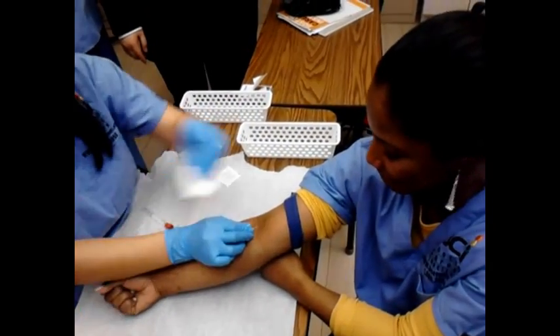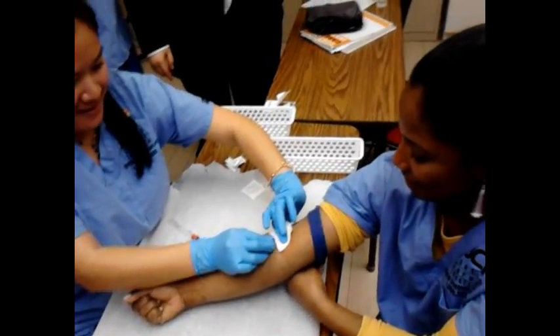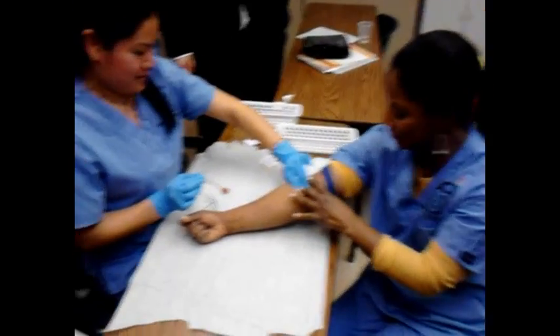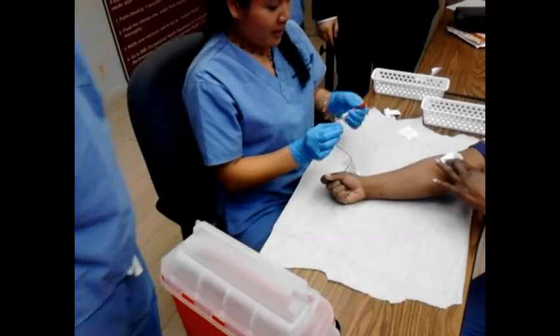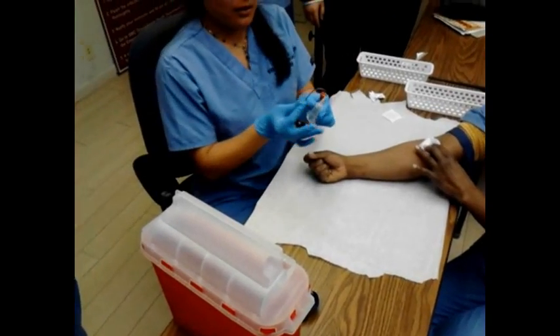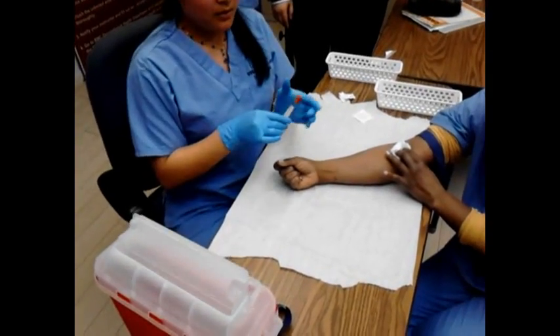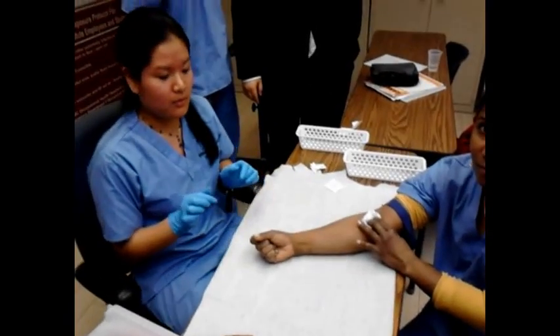Good. Now the ghost — see how you have to cross your hands to get it. Good, now hold it. Next time you put it on the left side. Now go ahead, throw it in the sharps container. It's just a bad tube, it's not you — see how it was popping out? Sometimes these tubes just lose pressure. Good job.